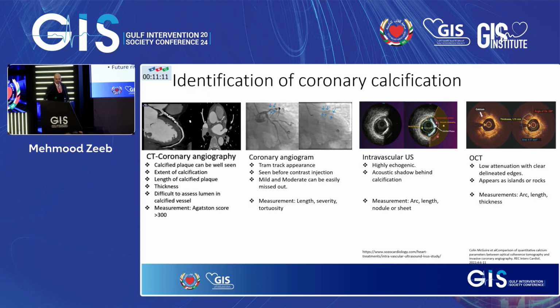and restenosis. Coronary calcification can be readily identified by most of the imaging modalities, including the CT coronary angiogram, where calcium scoring can also be performed, which is usually the initial investigation for the majority of patients, and can also help in preparation of the future intervention and management.